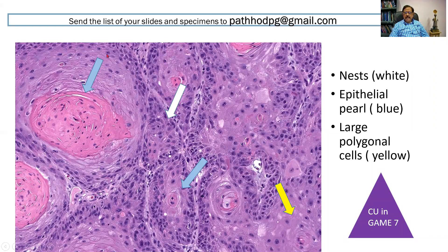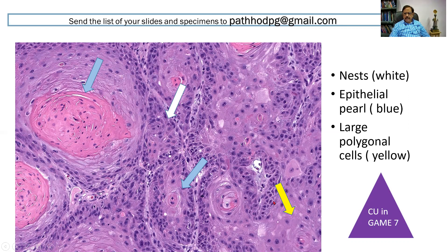And now, a slide for description. Look at the large nests of these tumor cells — the white arrow indicates the nest, and the blue arrow points to the epithelial pearl. In the examination, one such focus will be kept, and you can straight away make a diagnosis by means of the epithelial pearls. The yellow arrow indicates large polygonal cells. This is a slide of squamous cell carcinoma — absolutely no difficulty, and you can answer it in the examination.